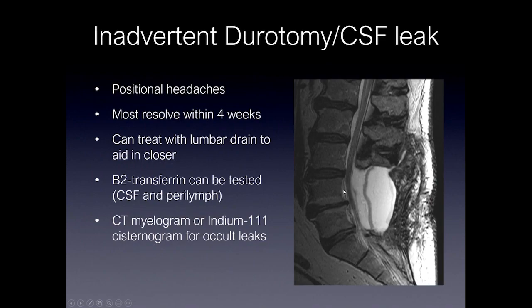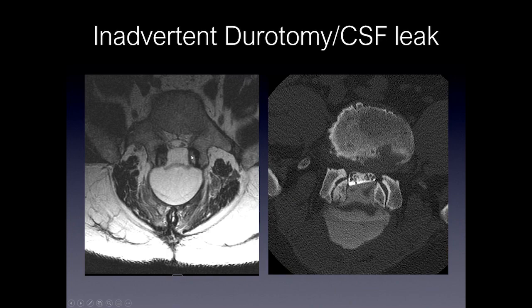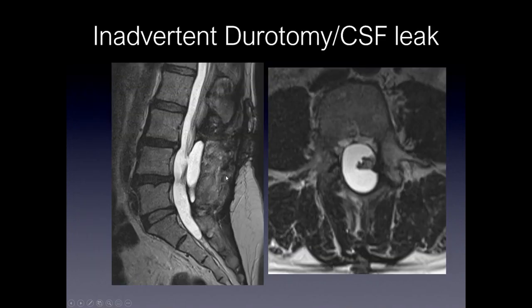Inadvertent durotomy or CSF leak can result from surgery. These can cause positional headaches and most resolve within four weeks, usually treatable with lumbar drain to aid in closure. If unsure whether a collection is a post-operative collection or CSF, you can send the fluid for beta-2 transferrin, which is only found in CSF and perilymph. A CT myelogram or indium-111 scan can also be performed for occult leaks. In one example after laminectomy, a myelogram clearly showed contrast spilling into the collection — consistent with a CSF leak. Another example clearly shows a connection between the thecal sac and the collection, confirming a CSF leak.